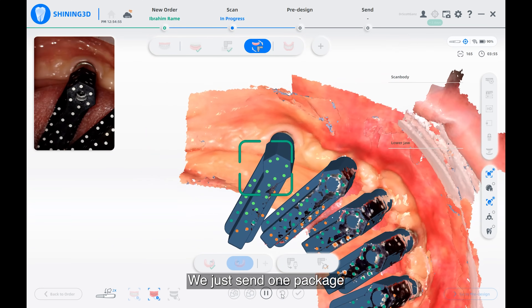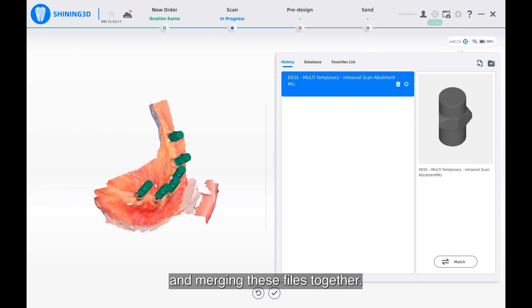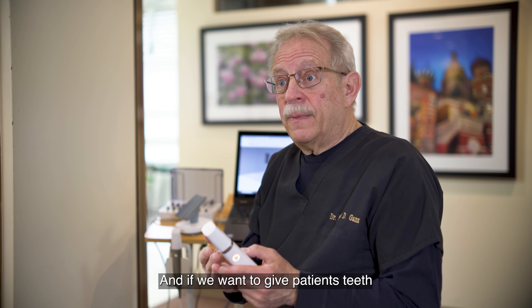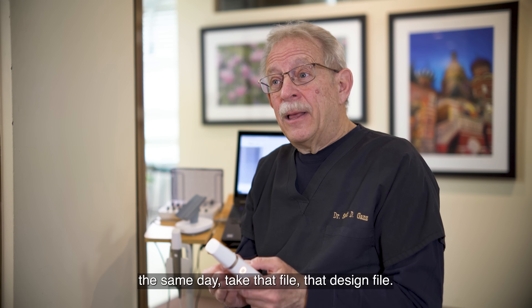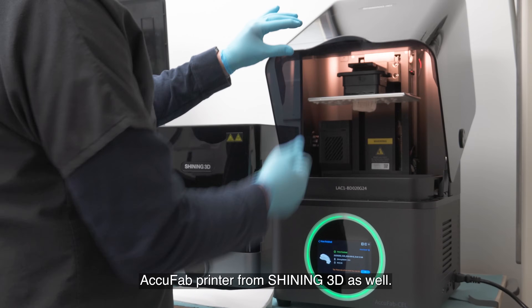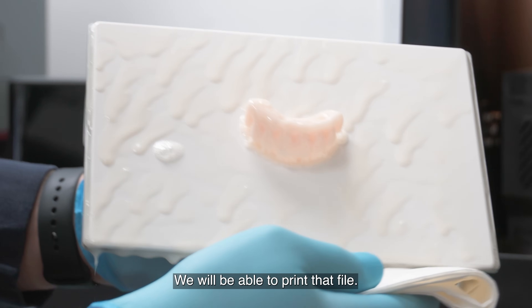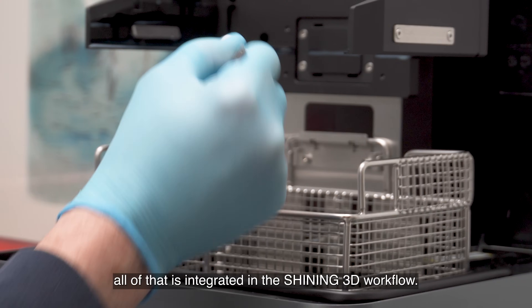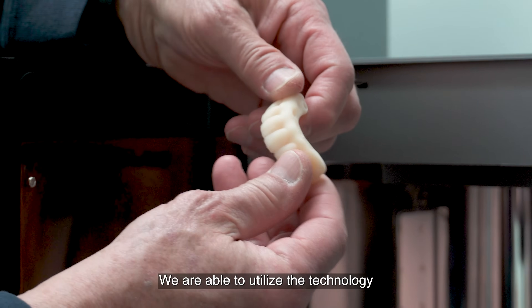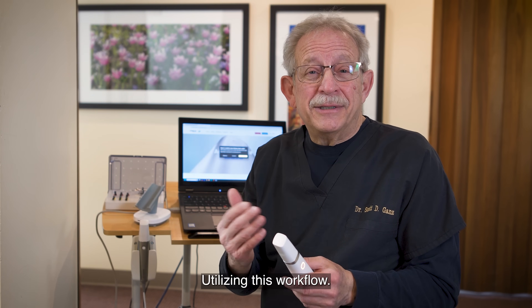We send just one package, and there is no manual merging of files — it's all done for you. If we want to give patients teeth the same day, we take that design file and put it on the AcuFab printer from Shining 3D. We print the file, wash, cure — all of that is integrated in the Shining 3D workflow. We are able to utilize the technology to its ultimate potential using this workflow.